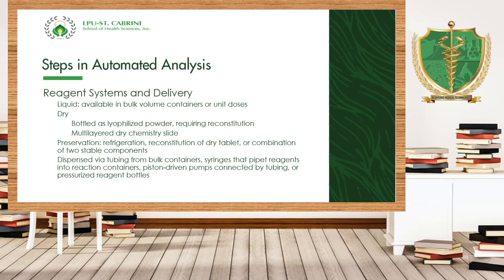We have the liquid, no, which is available in bulk, volume containers, or unit doses. So, kung saan mo ito mabibili, ay doon lang po mismo sa iyong supplier. And we have the dry chemistry, no, which uses the lyophilized powder or lyophilized serum. And then you have to reconstitute it, no, using the prescribed diluent.